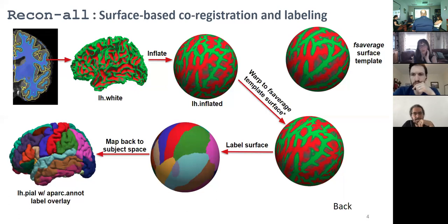So Jason, when you did that study, was it okay to create the template based on data that you would then use in the study, or did you base it on other child data? We based it on data that we use. I think I grabbed equal parts. That was actually 28. That's where the 28 comes from. I grabbed equal parts children, and tried to cover the range within each group: children who stutter, children who do not stutter, male, female, and in each of those groups go over the range of the ages.